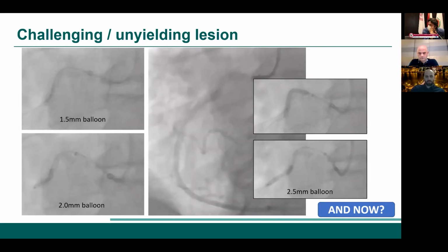We have a 90-degree bend, the lesion is proximal to this bend, and we have another lesion after it. If we treat the distal lesion, I think the rota will pass this 90 degrees slowly. But we have a lesion before this 90 degrees, and we have to think really about it before going for rota with any burr.